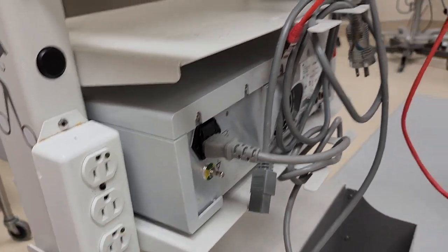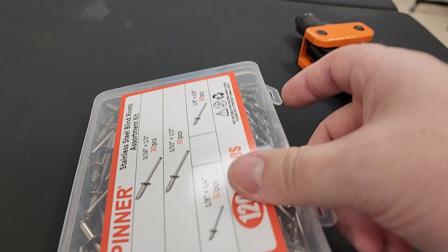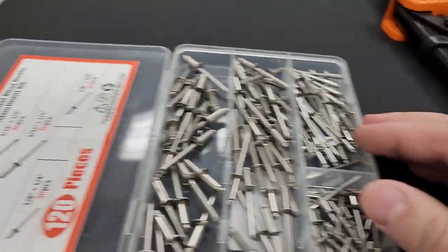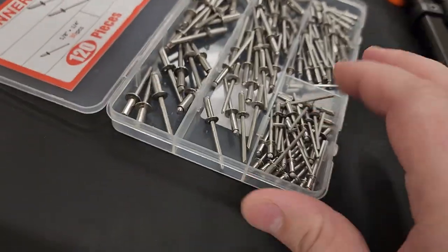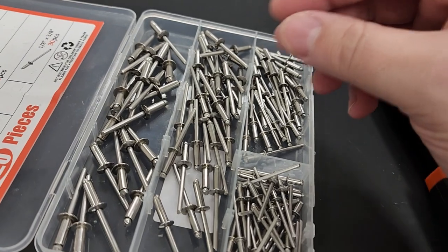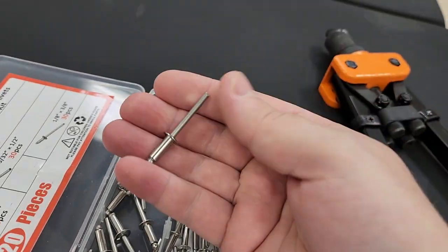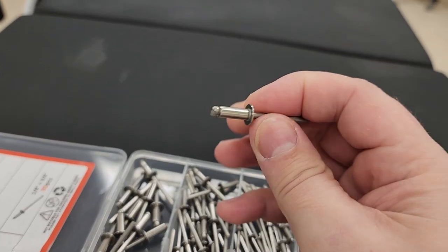That is a pop rivet. Now normally pop rivets are made out of aluminum, but these ones are special — they're made out of stainless steel. We do that not only for corrosion resistance but also for strength, because stainless steel is so much stronger than a typical aluminum pop rivet.